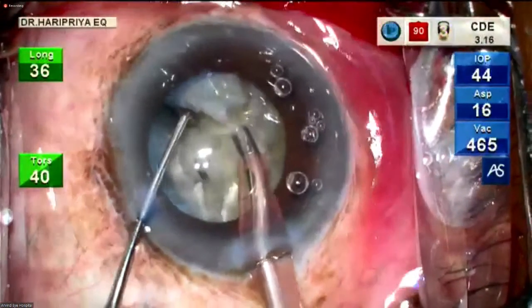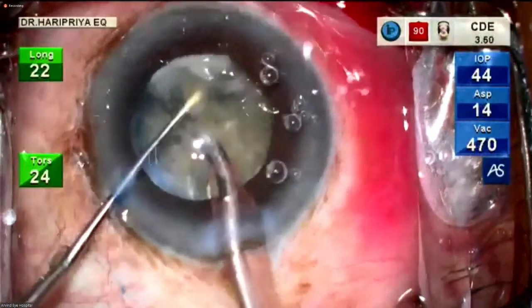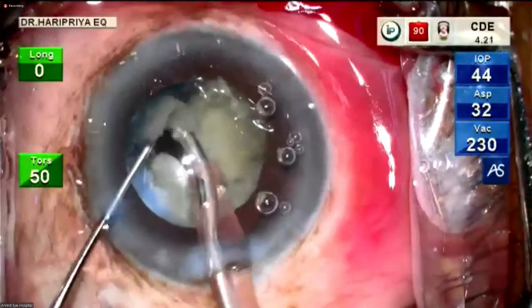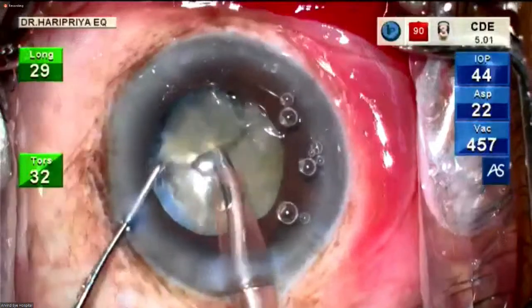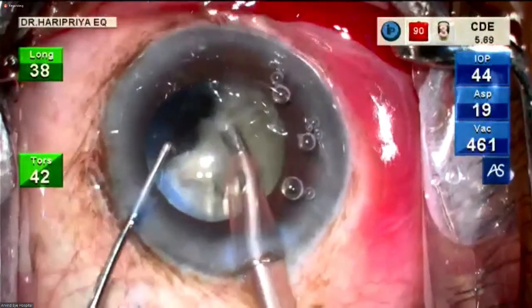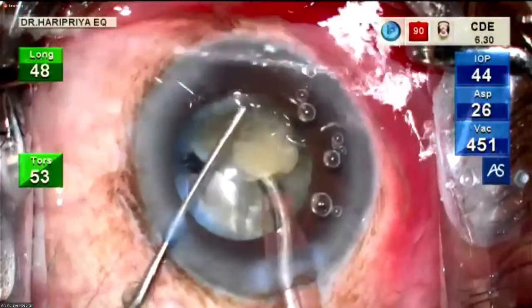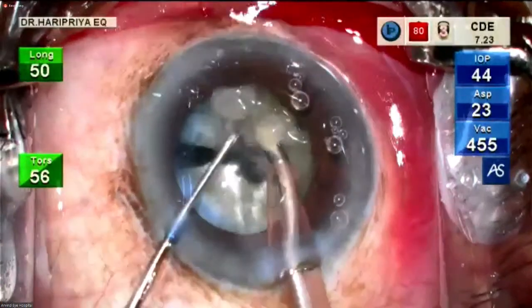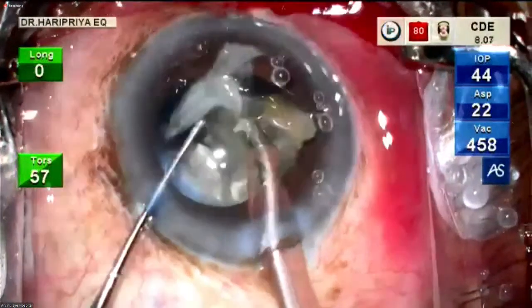In a mature lens, I think the absence of epinuclear bowl does increase the chance of having a bare PC and a PC rent. So again, it's very important to have a good fluidic system, and you only take the pieces one at a time. If you have one piece flying freely in the anterior chamber, I would normally take that piece first and then eat the other pieces in the bag after that.